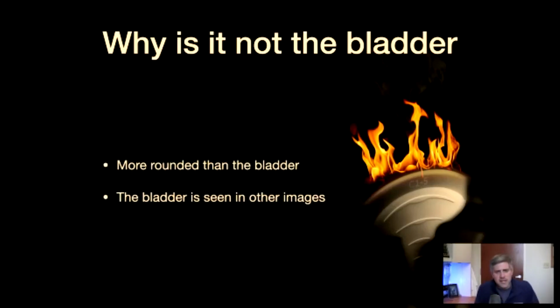And really, again, this is going to be the case for this study as well as for the subsequent case series that we have here, is make sure you identify the surrounding anatomy and scrutinize that, because that's really going to help you identify what your primary target is, or that primary structure that we're looking for, and confirm that it is or is not what you're thinking about.